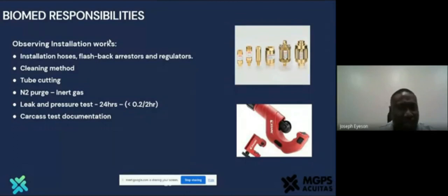As a biomedical engineer, you know that under no circumstance should a person use a hacksaw or any other thing to cut the pipe, other than a tube cutter, because it gives a seamless cut without any debris going into the pipe or showing at one end of the pipe.